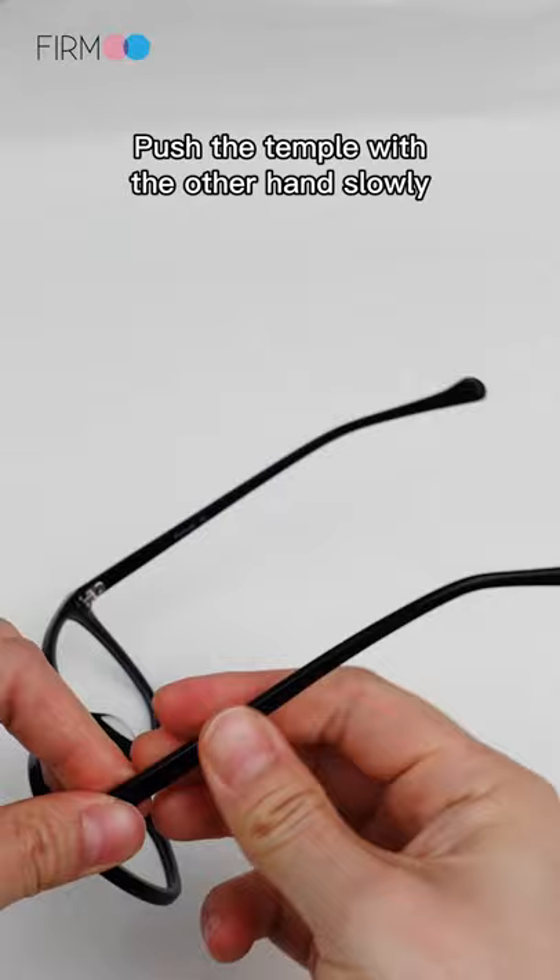Push the temple with the other hand slowly and forcefully while holding down the temple with one hand behind the hinge.